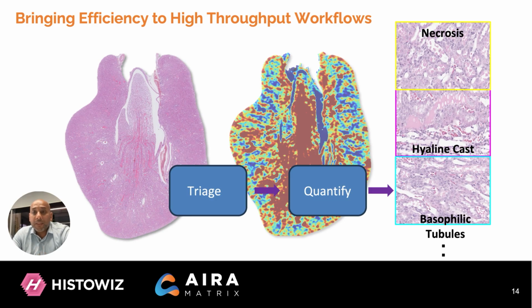most relevant samples. Once the AI detects potential slides with abnormalities, the pipeline advances to the identification and the quantification stage. These supervised deep learning models precisely classify and measure specific histopathological features.